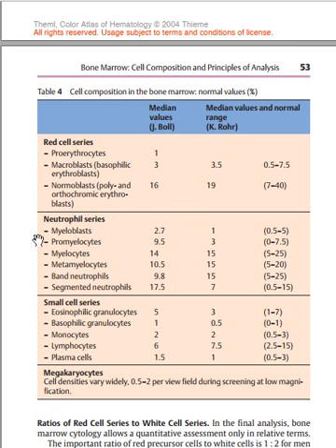The next structure inside the bone marrow is the neutrophil series, or the granulocyte series. Inside the granulocyte series it is actually very difficult to differentiate whether it is an eosinophil, neutrophil, or basophilic series. When they are precursors, you cannot easily distinguish each of them.